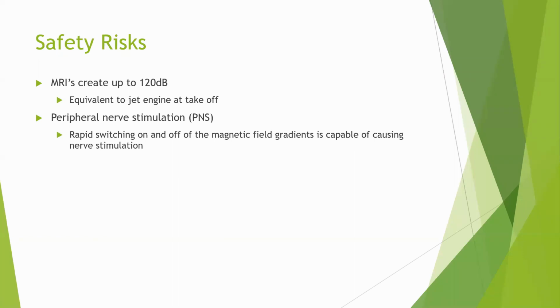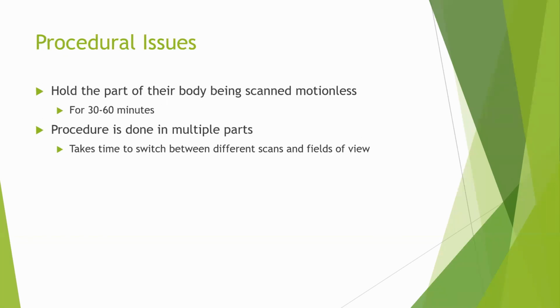All right? Okay. It's just simple. Procedural issues. What do you mean by that? You have to stay motionless. When I went through an MR process, I just closed my eyes. I was listening to some music and I lay motionless as much as possible and just rested there.